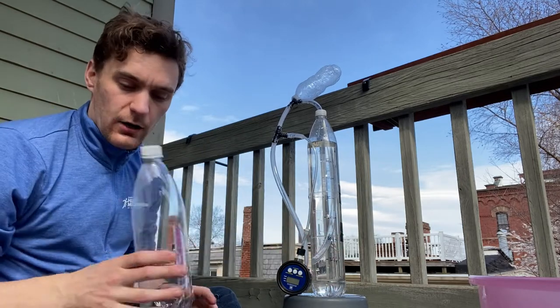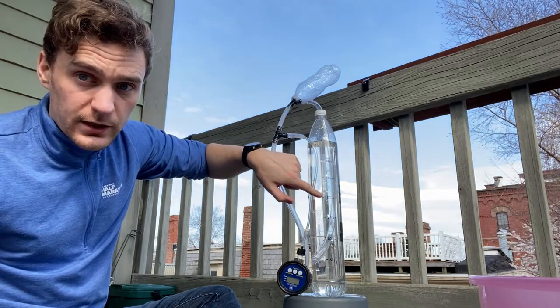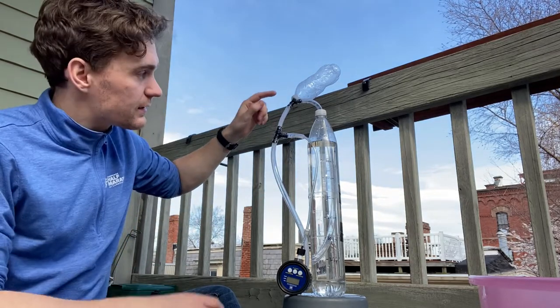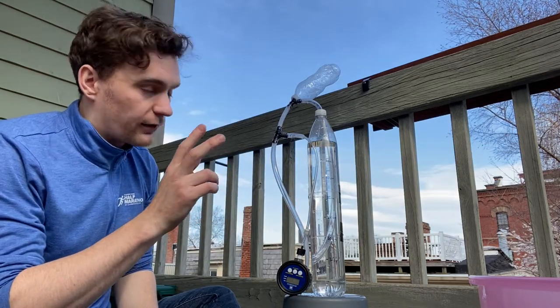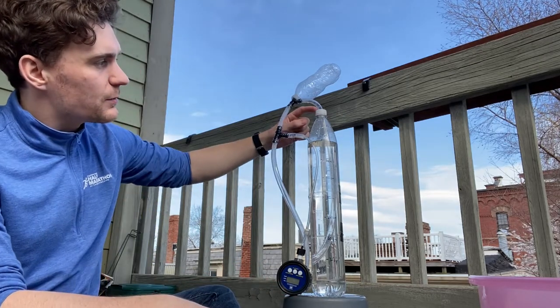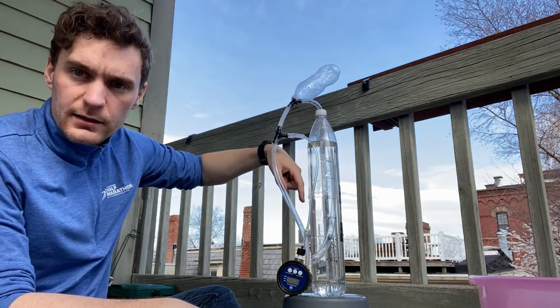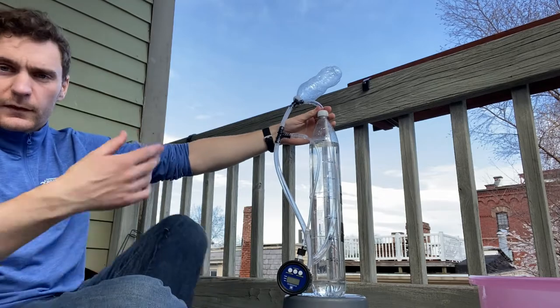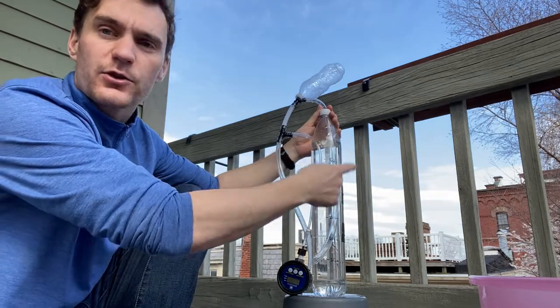To summarize: firstly, this can be used as a pressure gauge — how far down the tube is tells you the pressure. Secondly, it can be used for pressure regulation, because if you apply higher pressure than the set point, the excess comes out through the tube. Thirdly, it can be used for humidification: you would have a sealed container with an air inlet dropping a little bit into the water, then a tube coming out of the top so all the air passes through the water.